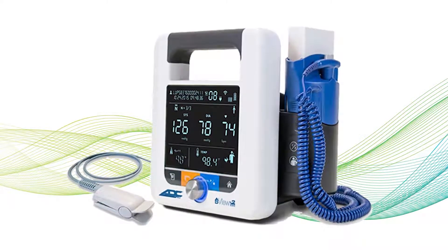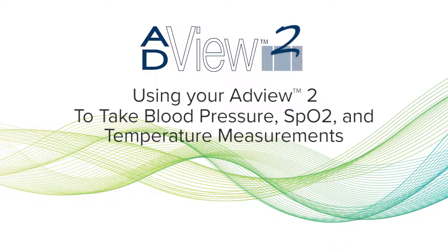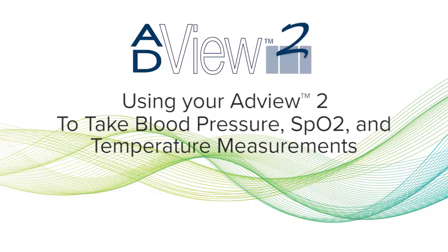Welcome to ADC's series of instructional videos for the AdVue 2 Modular Diagnostic Station. In this video, we'll show you how to use all the AdVue 2 modules simultaneously.